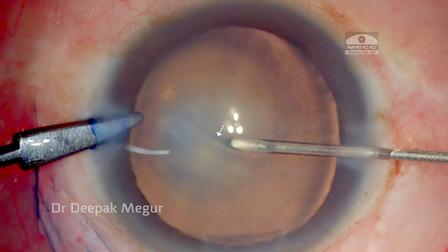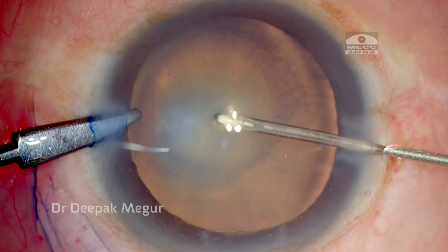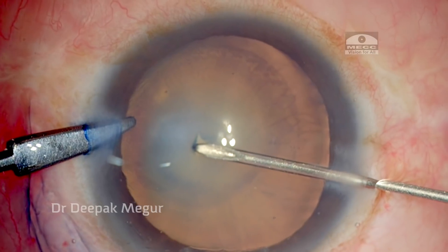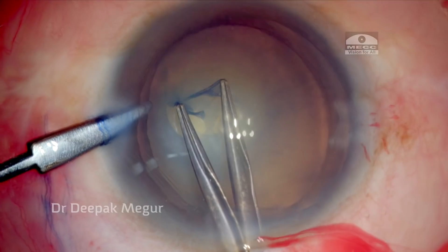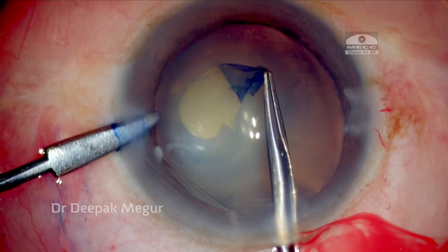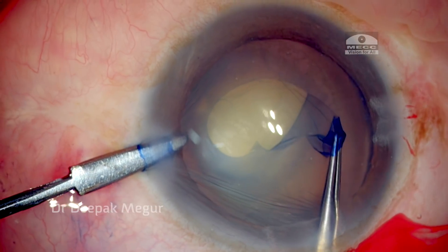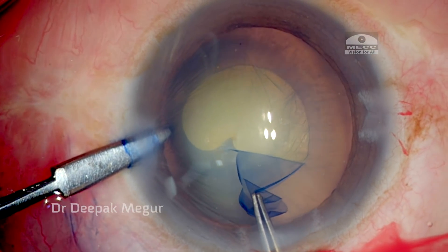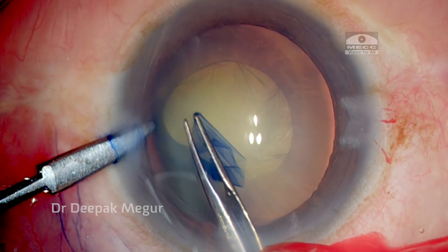As soon as I puncture the anterior capsule, you can see the radial fold in the anterior capsule, which clearly tells a story about the health of the zonules. In eyes with weak zonules, forceps is always the best bet — I am using the Haldipurka forceps, aiming to perform a 5 millimeter capsulorhexis for a planned optic capture later.